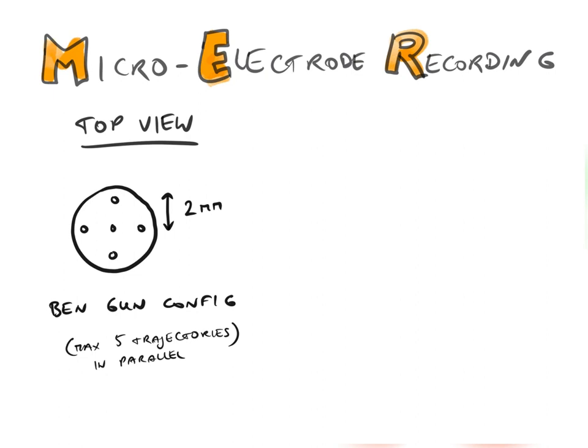So we bring in the electrodes, we start about 10 millimeters before the target, and then we go deeper in steps by 1 millimeter or 0.5 millimeter. And we look at the signals, we listen to the signals, and when we get to the target coordinate, we see changes in the signal, which we use to define the theoretically best trajectory. And then we confirm if this is really the best trajectory by stimulating to see what is the effect, and also very important, what are side effects.